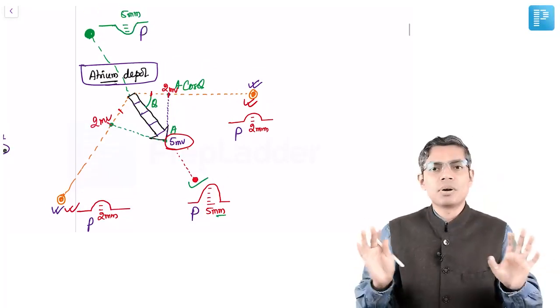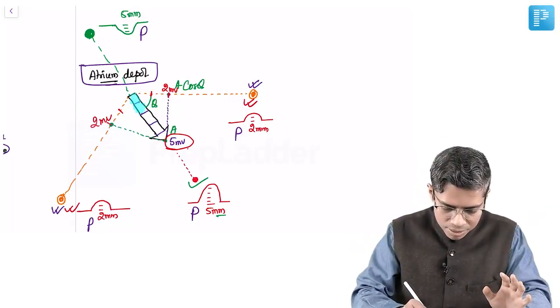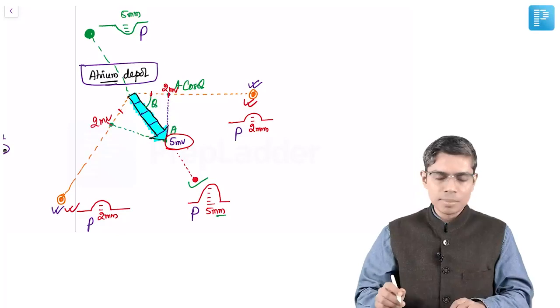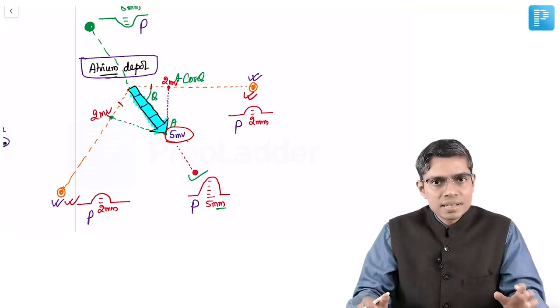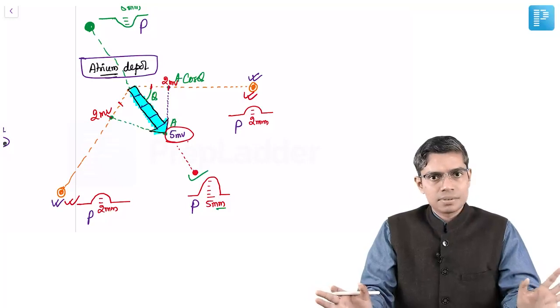So all of them are P wave. All of them are generated by a single voltage vector, and this voltage vector is nothing but the instantaneous mean vector, which is generated due to atrial depolarization. But look, the amplitude of this P wave is not equal in all these leads. The amplitude will be different according to the mathematics, according to the vectorial analysis, right?